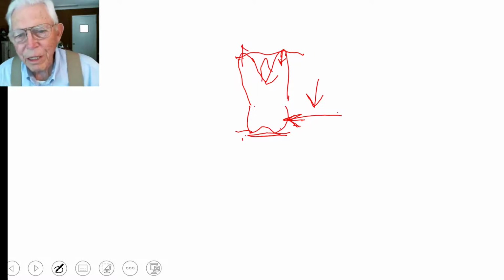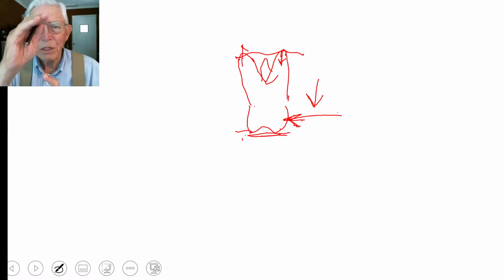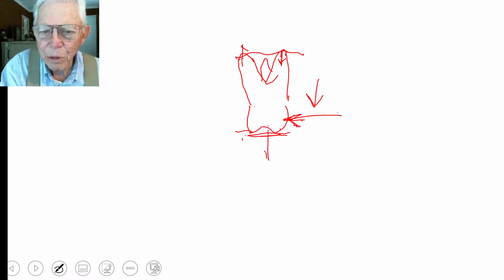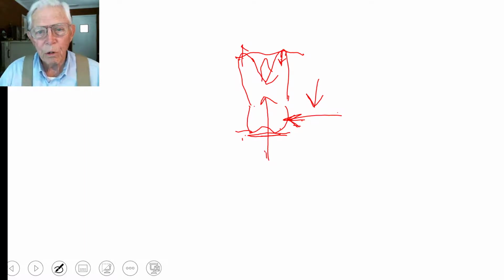If you can get this down in your mind, it doesn't matter what tooth it is in the head. If I push on that tooth right there, it tends to drop just slightly as it goes over in that fashion. The only force you can put on this tooth that makes it intrude is to put something straight onto it like that. Then that will make the tooth go.